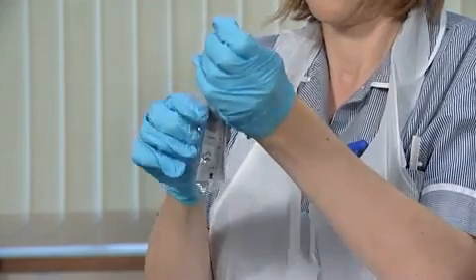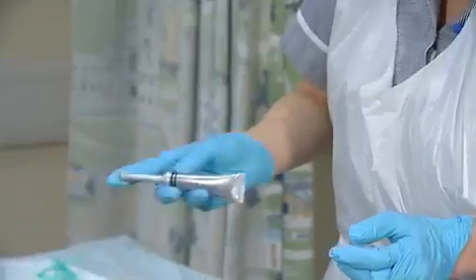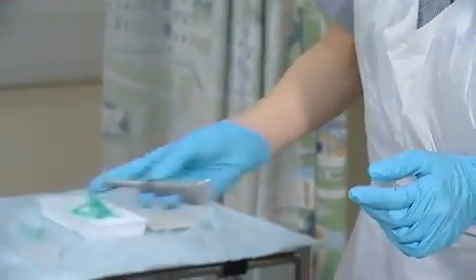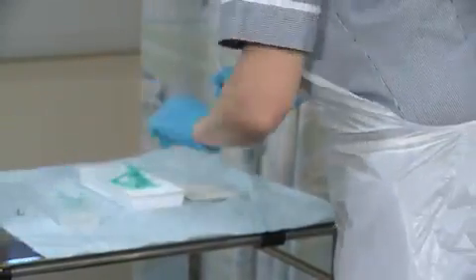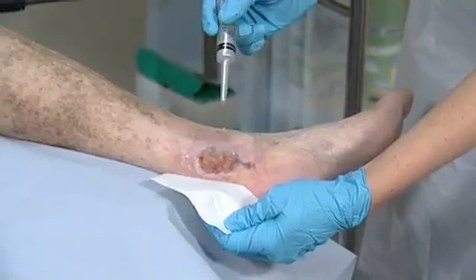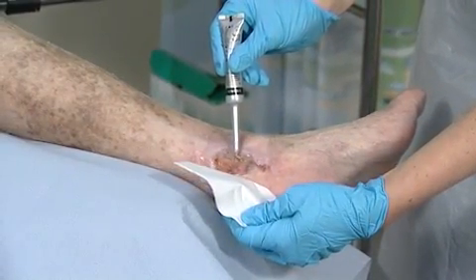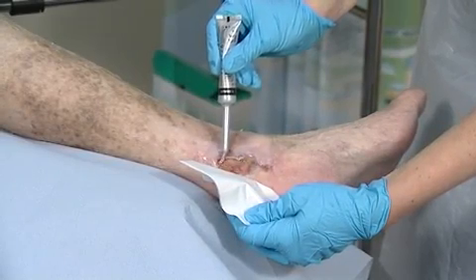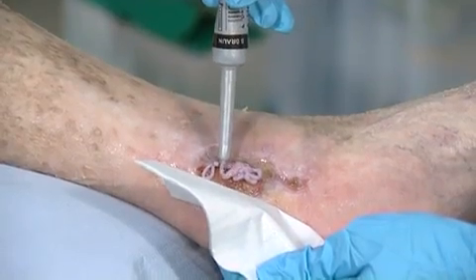Remove the tube from its packaging, shake the tube and remove the cap. Apply a thick layer to the wound, ensuring that the entire wound bed is covered, leaving no dead spaces where bacteria could grow.